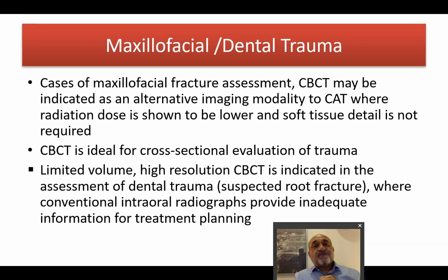Second, in cases of trauma, especially when there is bleeding, whether a moderate amount or massive amounts of blood, especially in big quantities, tends to mask the small fracture sites. So the small fracture again will be hidden by the bleeding site.